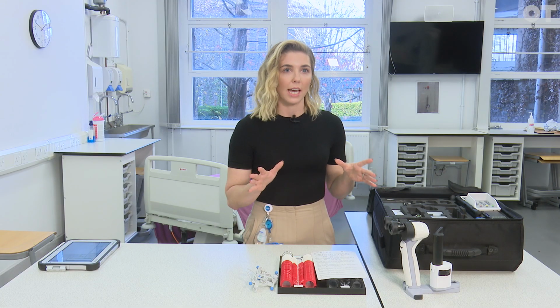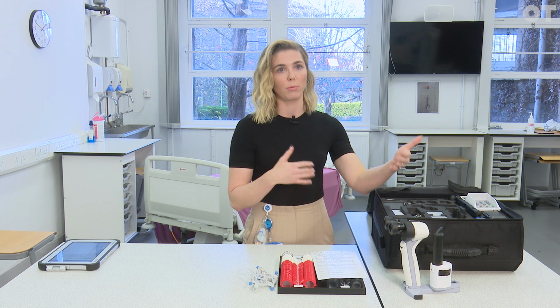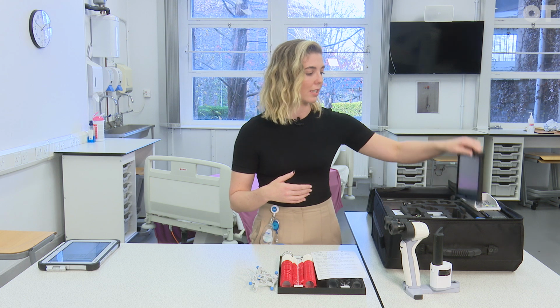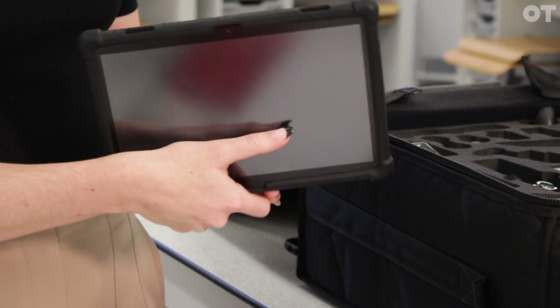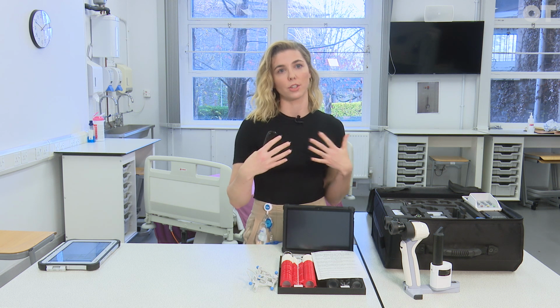In order to actually test and use a chart, we need to test at an appropriate distance. We normally use 3 meters because we can use that in someone's home. So we've got a test chart that's adapted for that. We use an iPad that also has a remote control, so we can use that from the other side of the room and we're not having to go backwards and forwards.